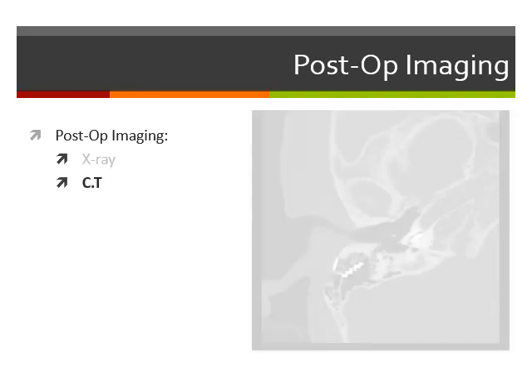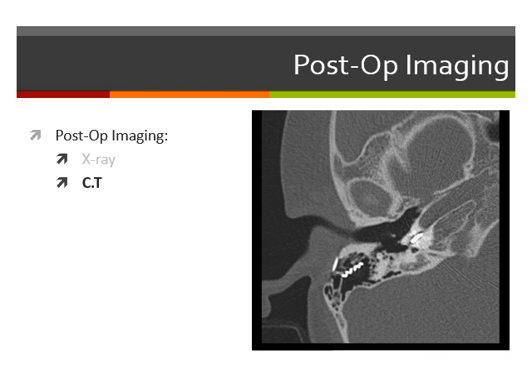Now let's talk about postoperative CT. Of course, as I have just mentioned, you can do it with cone beam or multi-detector, but the main disadvantage of cone beam is that you need your child to remain steady without any movement of the head, because any movement of the head will create an artifact and make the imaging less perfect. So multi-detector CT as a pre or post-operative option could be much better than cone beam, especially for children.